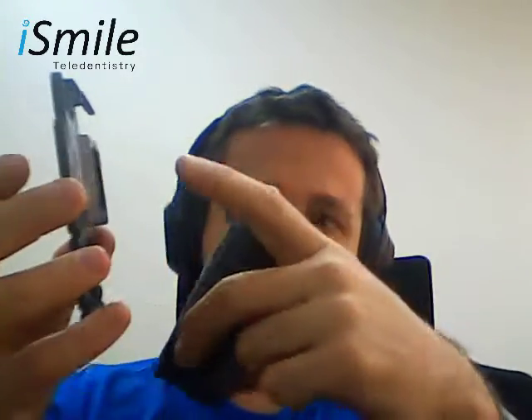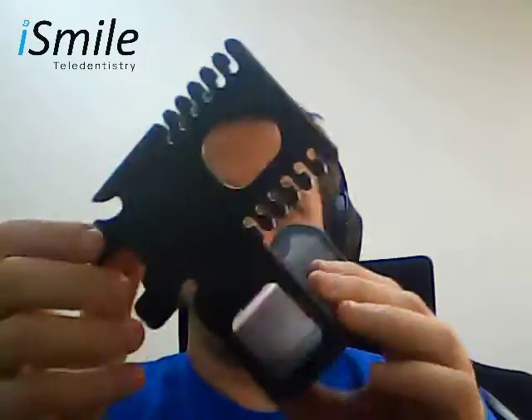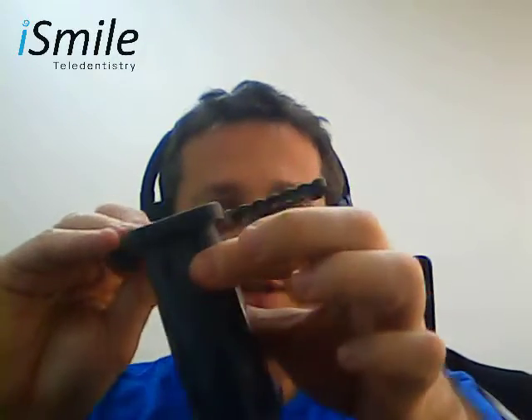In your other hand, squeeze the clips on either side of the scope and align the bulges on the scope to the indentations on the flat piece. While squeezing the clips together, insert the scope into the flat piece until you hear a click and the scope and the flat piece are now securely fastened to each other.